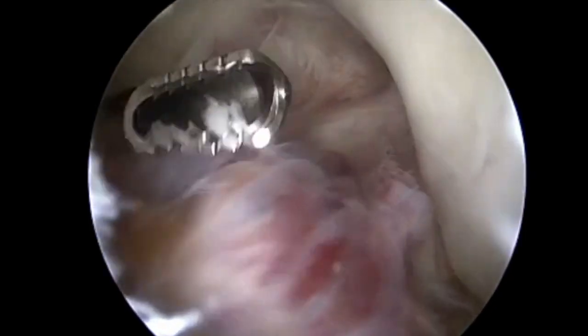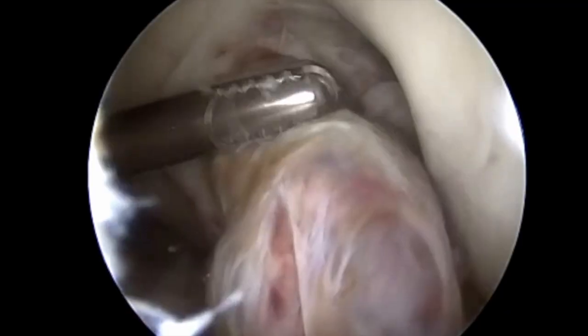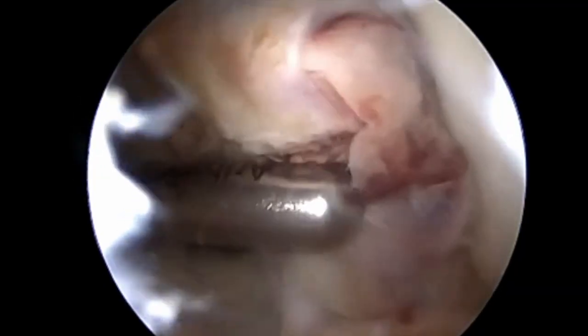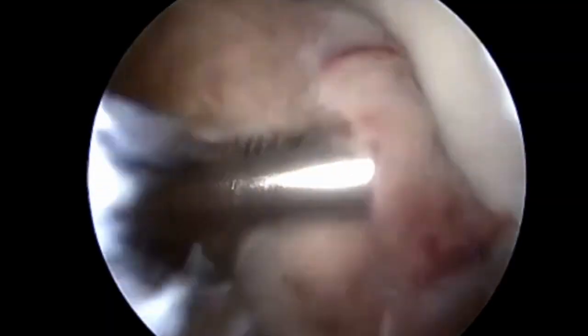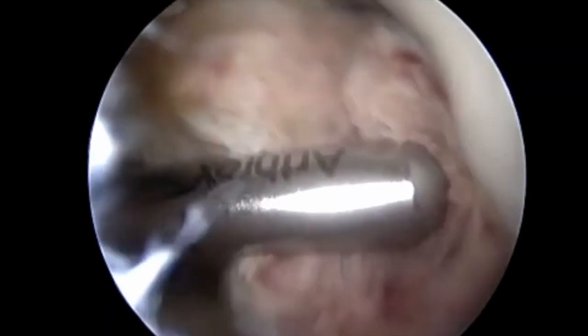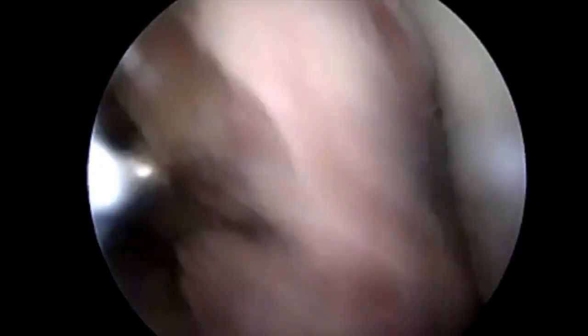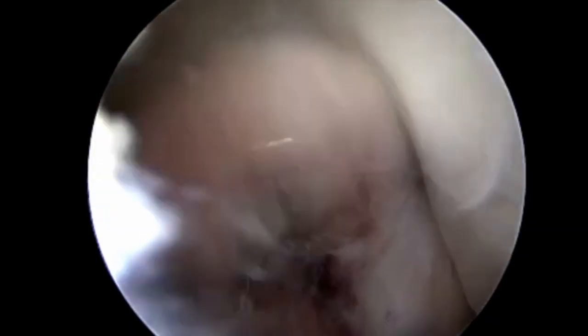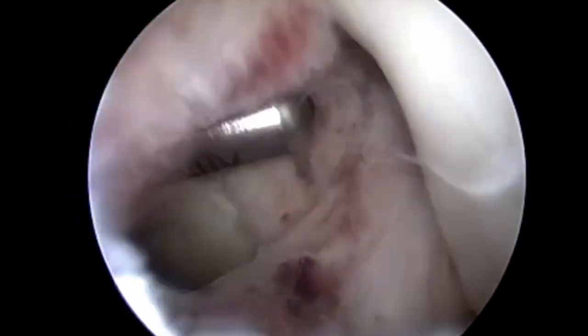A motorized shaver was then introduced to begin the debridement process, with careful attention not to disrupt the ACL graft, as this fibrotic tissue can be closely adhered to the graft. A probe can sometimes be used to develop the plane in between them. In addition, part of the fibrosis can extend into the intercondylar notch as well as the native PCL, as demonstrated here. Careful debridement should also be completed in this position as well.